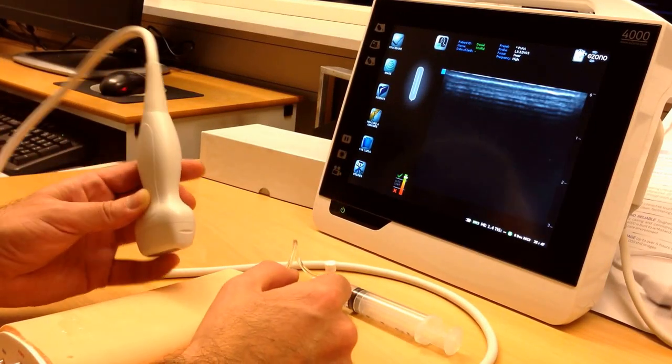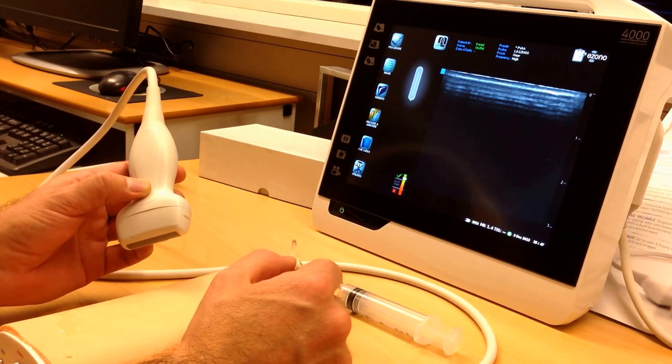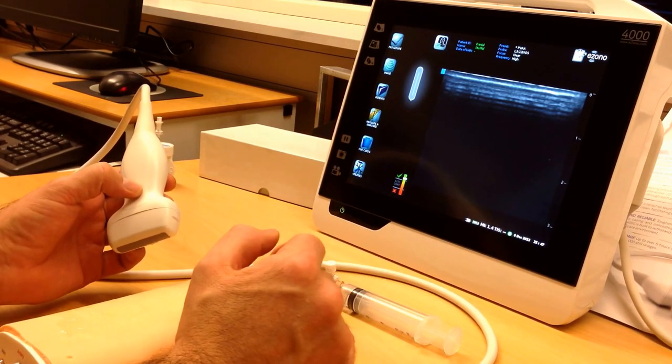Hi guys, this is Daniel checking out the new eZono 4000 with needle guidance systems for you. We just got this one in the house today.